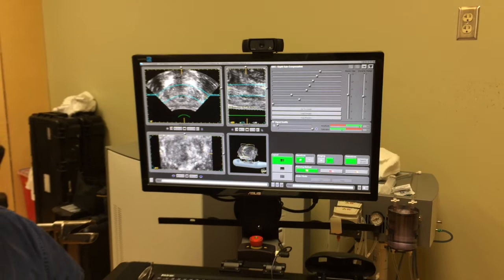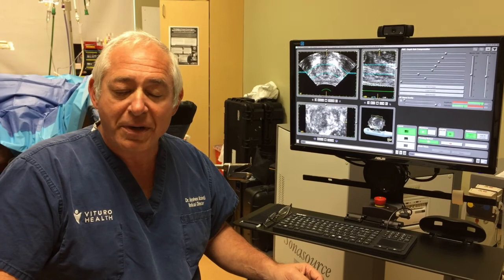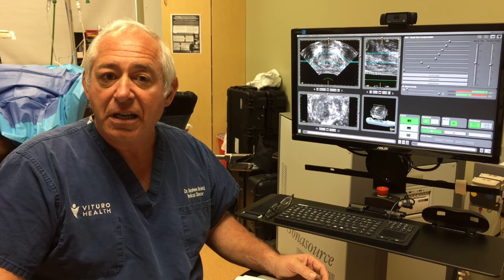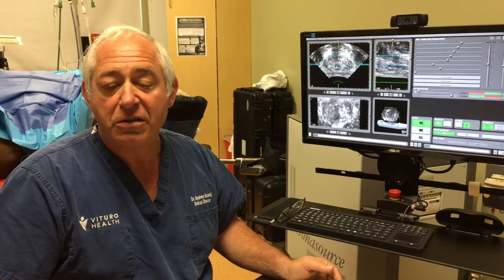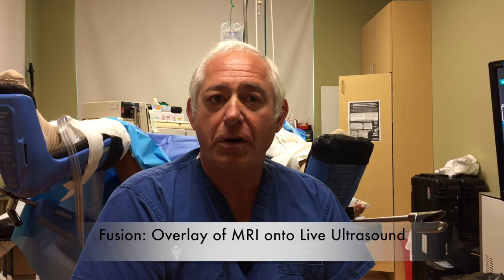We're going to import the MRI images, create a three-dimensional model of the prostate based on the MRI. We'll be able to see the tumor as determined by the MRI images, and then we'll be able to map the MRI images directly onto the ultrasound images so that I can appropriately direct a very high dosage of energy to this very dangerous tumor. We're now performing what's called the MRI to ultrasound fusion, which is a critical first step to the triple M technique — the MRI mapped energy modulated technique.